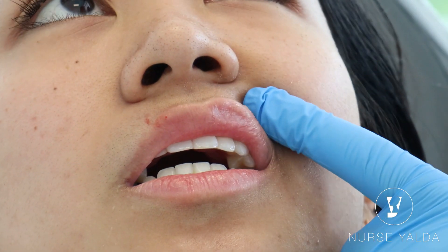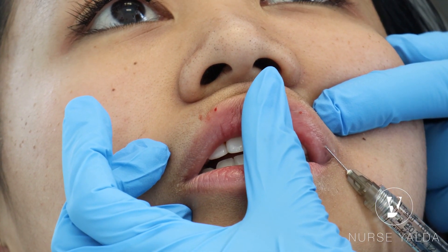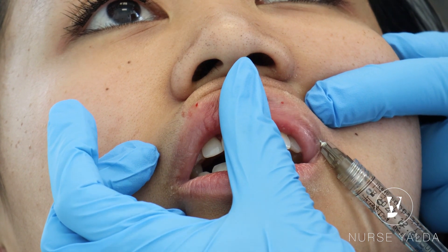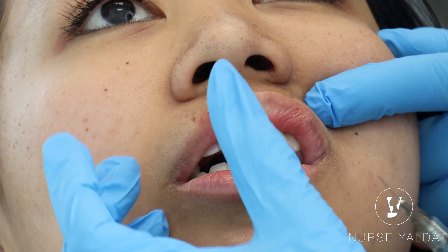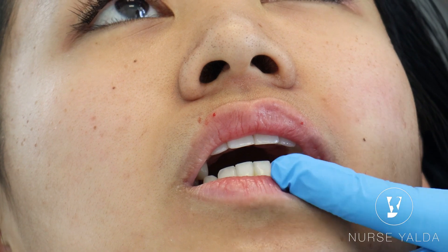Keep coming out, keep coming out — push and pull back, push and pull back. Good job. Now from the corner of the lip, with the non-dominant finger — make sure you stay centered. I can assist you so you're more comfortable. Stay in the center: you don't want to add product to her wet border, and you don't want to add product to the white border. This is white, this is wet, and this is dry.